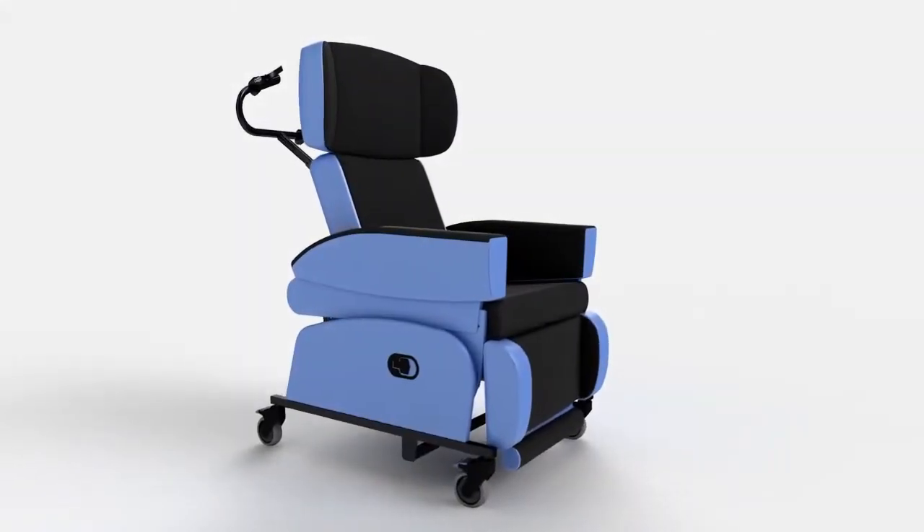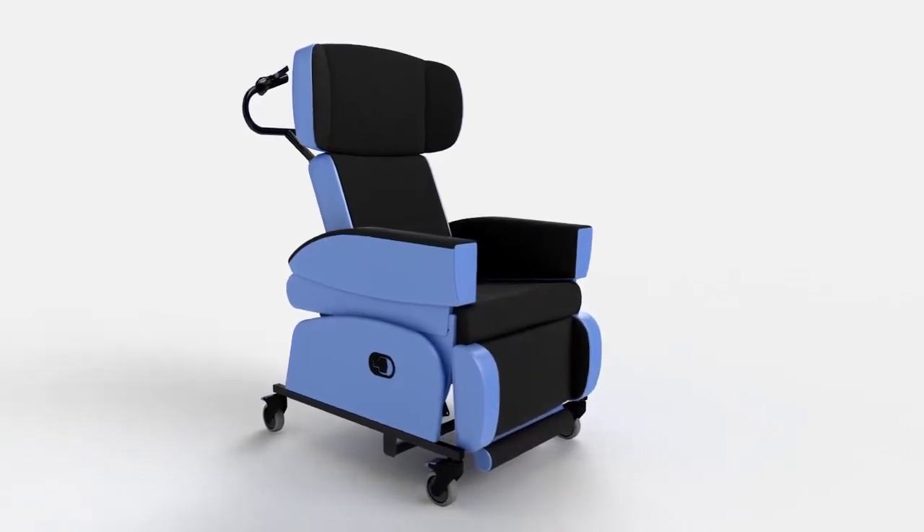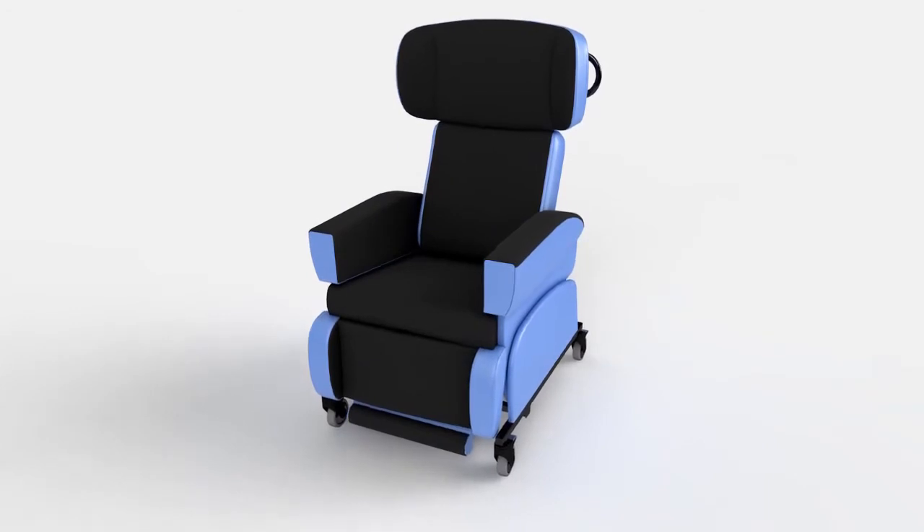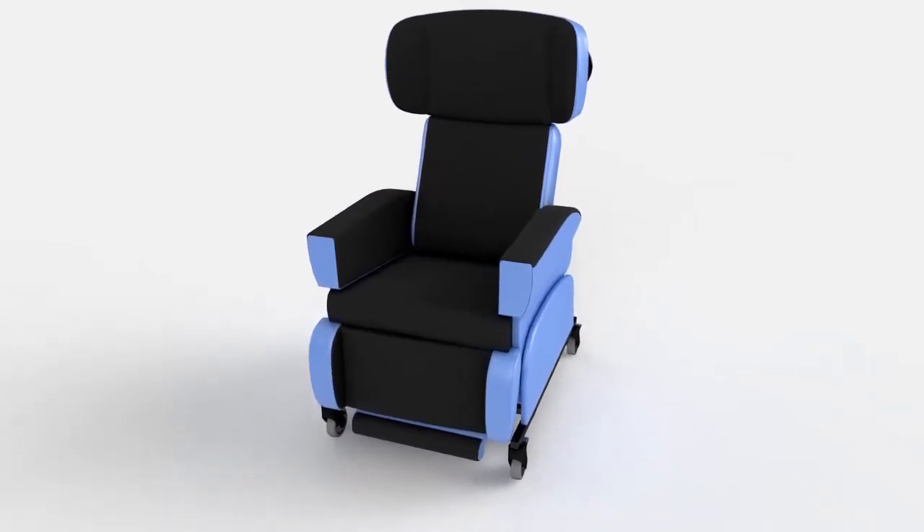The HydroFlex is the flexible rehabilitation chair that offers high levels of adaptability for those with more complex posture and pressure management needs in any care environment.